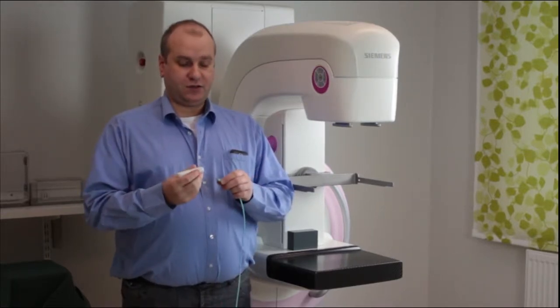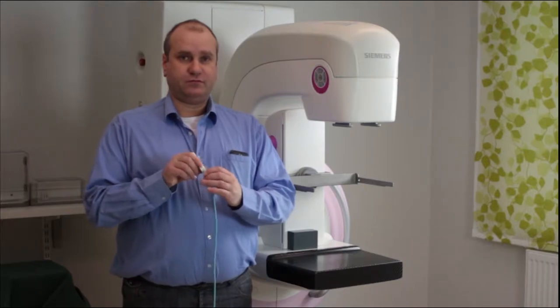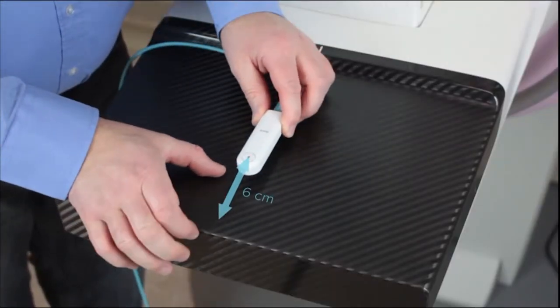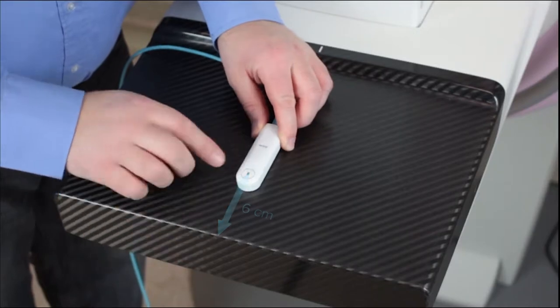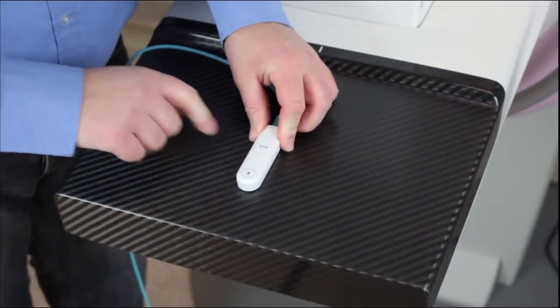First connect the USB cable. Place the sensor 6 centimeters from the chest wall side or according to local regulations.